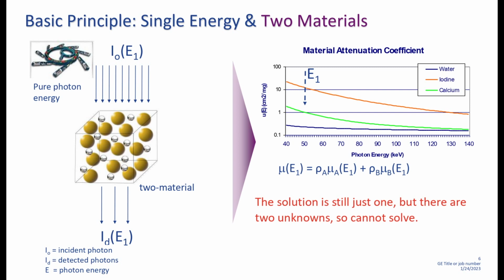But in real life, the scenario is different. Water and iodine. Now if I measure the attenuation using a single energy, and I ask this question, can you say how much is attenuation from water, how much is attenuation from iodine? Can you measure? You cannot, because what you are going to get here is a sum of the attenuation. This is exactly the problem with current day CTs. What you measure is the sum of the attenuation. This is what I explained in the first slide.